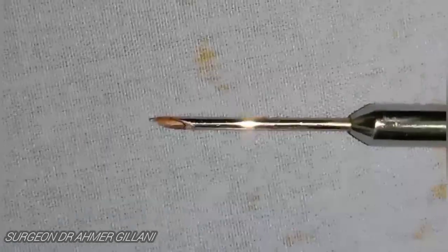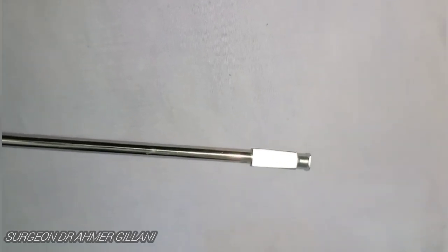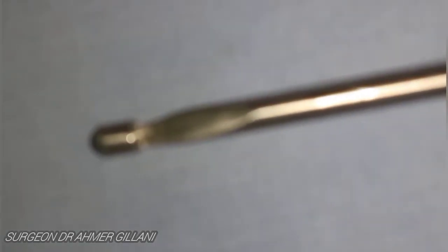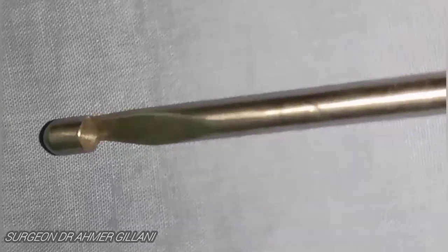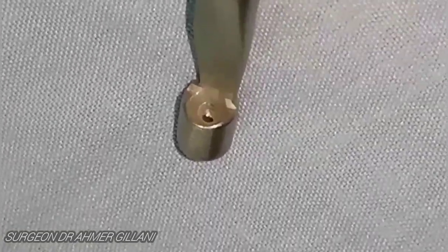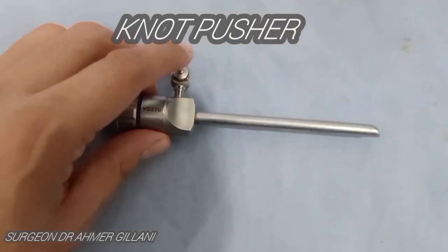This is the zoomed-out final view of the next instrument, which is also one of the most commonly used laparoscopic instruments — basically the knot pusher. When focused, you will see there is a hole in its tip through which the suture will be passed and pushed. This is the knot pusher.